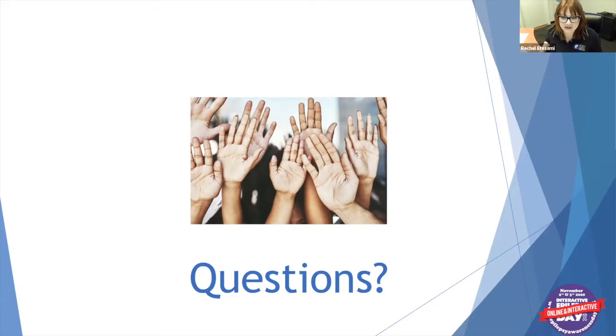Okay, so into questions for you, Dr. Skora. What type of scenario will an ambulatory EEG be best? Yeah, great question. So with ambulatory EEGs, sometimes we run into this problem where children have episodes that sound maybe concerning, that they could be seizures. And then we may bring them into the hospital, and for whatever reason, the hospital is not the home environment and they don't have the episodes of concern.